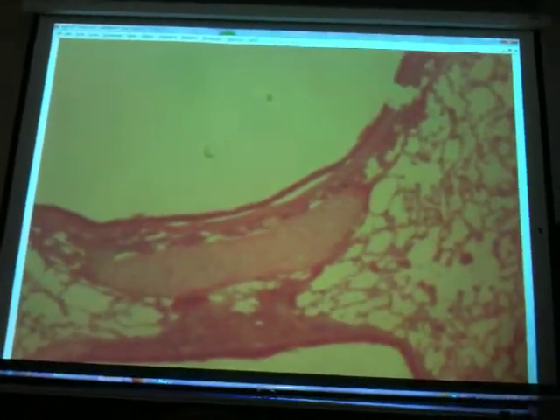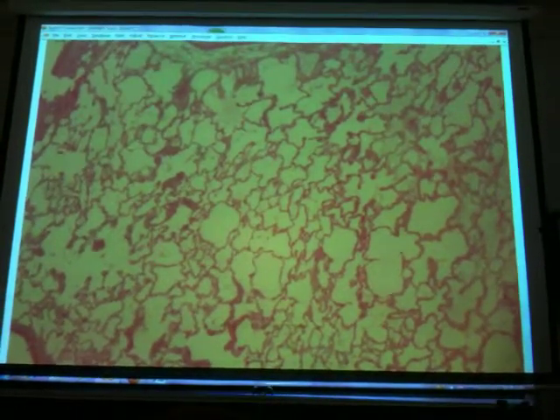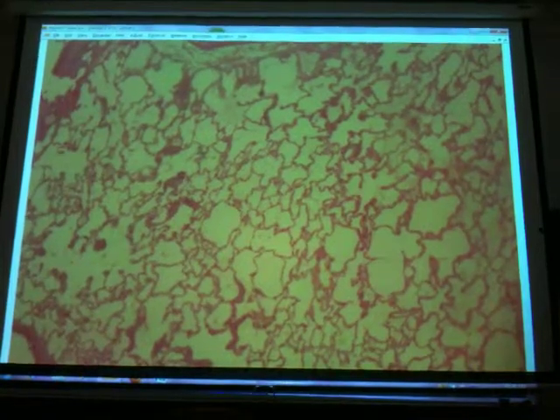Cartilage is a structure. Now, when you see something that is filled with air, like this is, all those luminal spaces, this is the lung. So the organ is the lung. You have to be able to recognize the organ, okay? That's the easiest thing you could do.